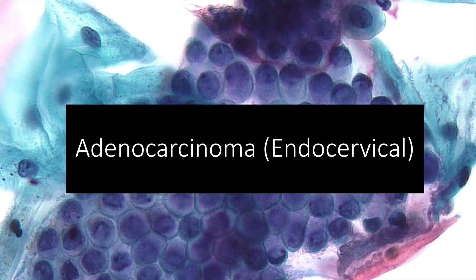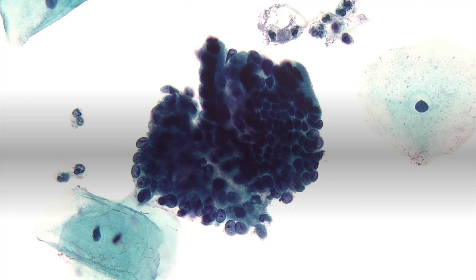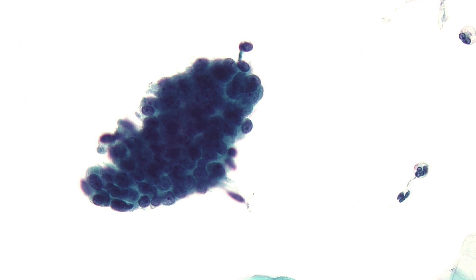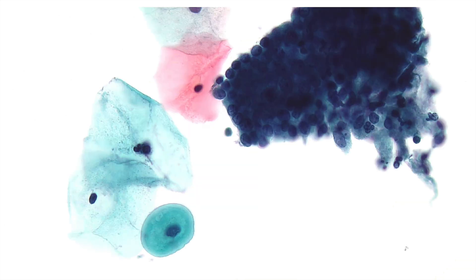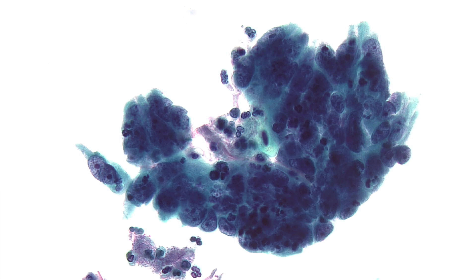Now we'll discuss adenocarcinoma endocervical type. In this group, abundant abnormal cells are typically present with columnar configuration. Liquid-based preparations show more three-dimensional clusters. A suggestion of clinging diathesis is noted at the edges of the cell group, though this is less prominent in liquid preparations. In poorly differentiated cases, disorganization is more marked, with cellular pleomorphism, nuclear overlap, increased nuclear-to-cytoplasmic ratios, clinging diathesis, and easily noted apoptosis and mitotic figures.